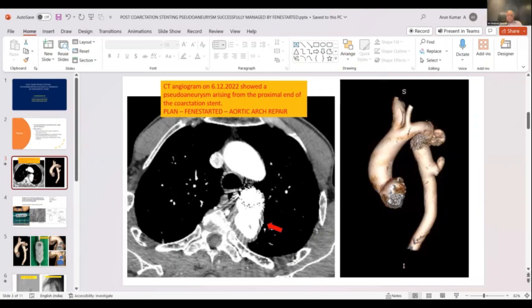How do you avoid trauma to the intercostal arteries? Many of these patients will have intercostal arteries that are aneurysmally dilated in coarctation. And how do we get control over such a situation? Yes, sir. Actually, we have done a few cases of total aortic repairs from ascending to bifurcation also. Usually we stage the procedure in those cases. Initially we repair till the celiac artery, then we give a maximum of 2 or 3 months, then we repair below.